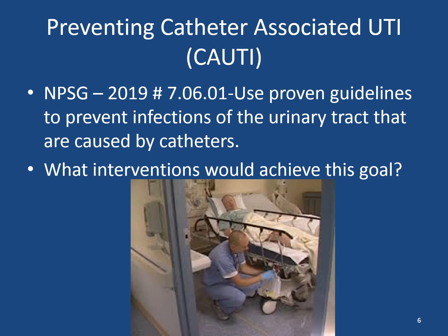Make sure that we're emptying it every 8 hours and as needed, especially if it's filling up. We want to use a separate clean container for each client. We're not sharing urinary containers to empty the urine into. And don't touch the spigot where the urine is coming out to the container. We want to make sure that we maintain that area as well.